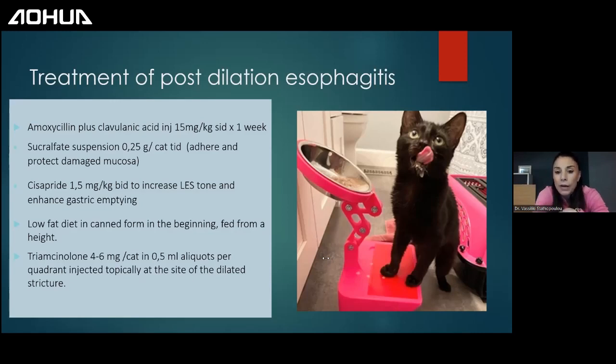And if you don't want perforations in the beginning when you're doing your procedures, try it with a balloon of smaller diameter. You will not have the therapeutic effect that you want, but you will definitely start to do the procedure. And once you feel safe, then you will be more aggressive, as I was.